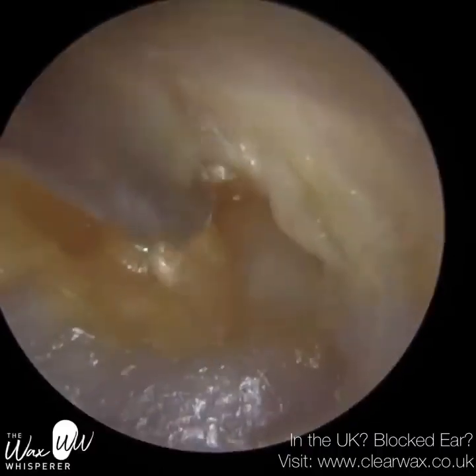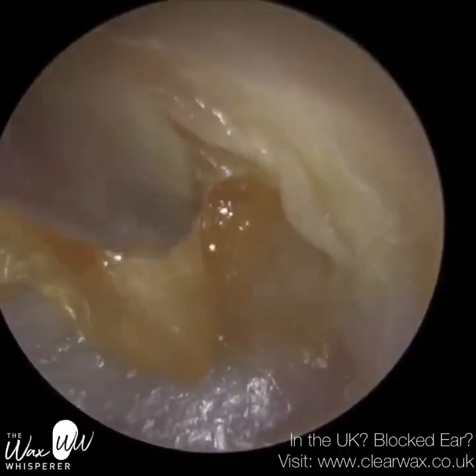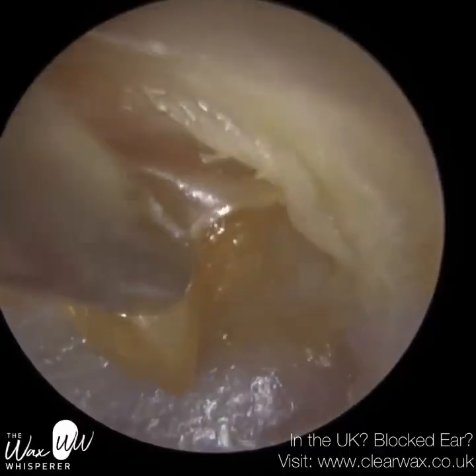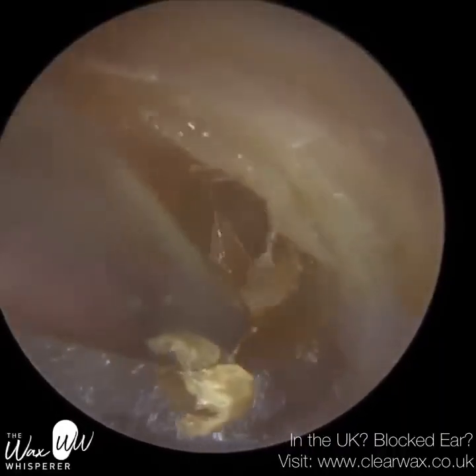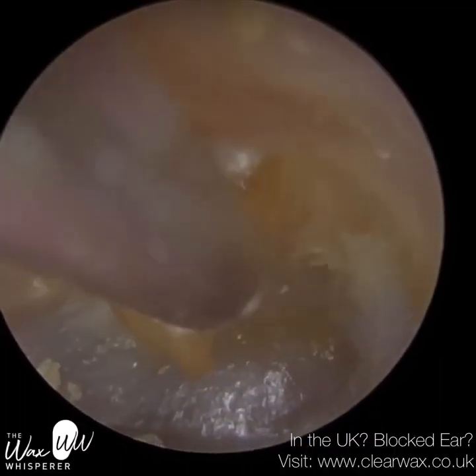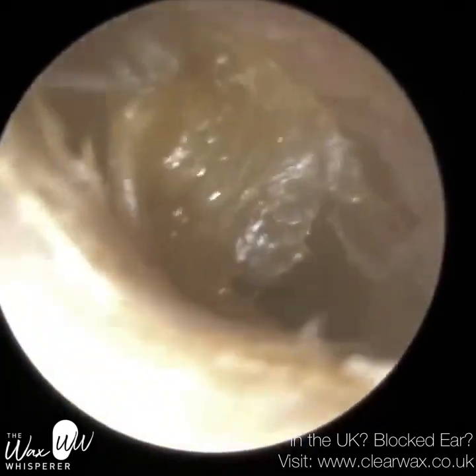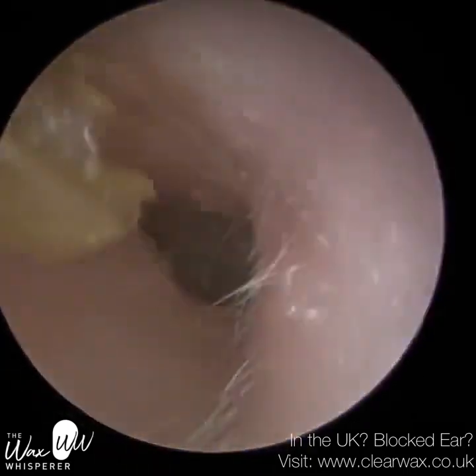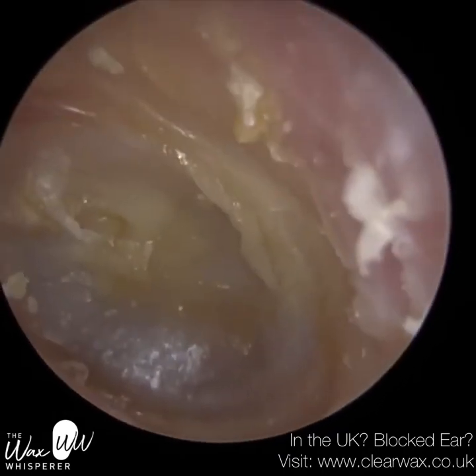You've got different layers here, and you can see I've got that thick layer there at the back, and I'm just gently working out the retraction. So why is this patient's eardrum retracted? Behind the eardrum, we have the middle ear, and the middle ear cavity should be air-filled, and the air pressure in the middle ear should be equal and at equilibrium with the air pressure in the ear canal, so the external atmosphere.